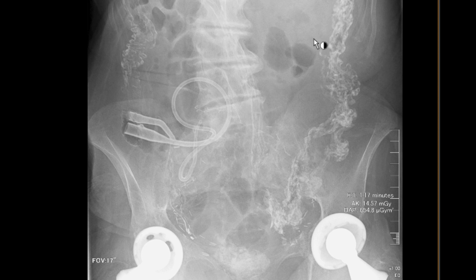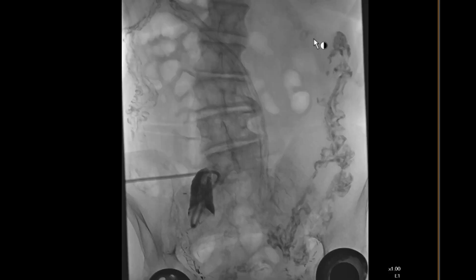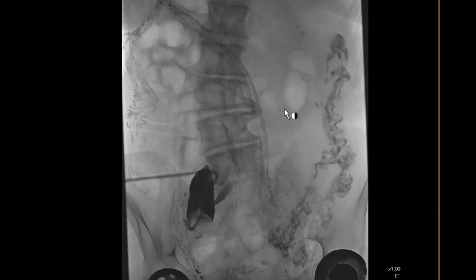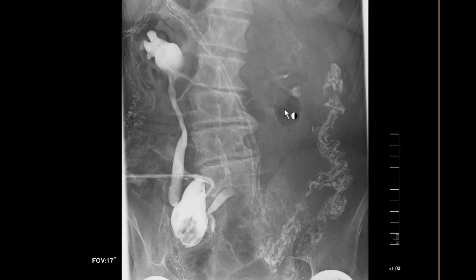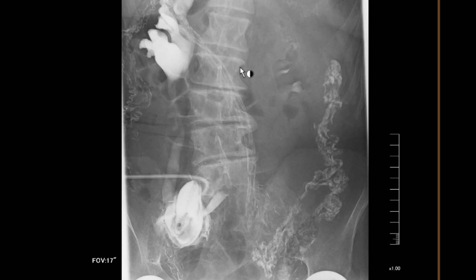So here we have a loopogram. This is the scout image. There's some contrast from a prior study in the colon, but as we cannulate the ileal conduit, the Foley catheter ejects some contrast into it. We can see that there is some opacification of the left ureter, and eventually some opacification of the right ureter and right collecting system, which is hydronephrotic.